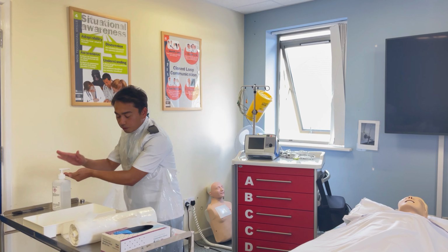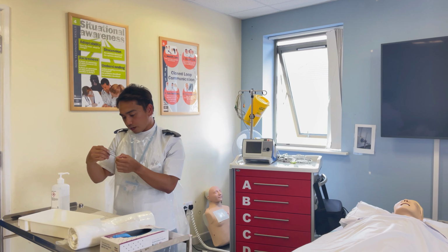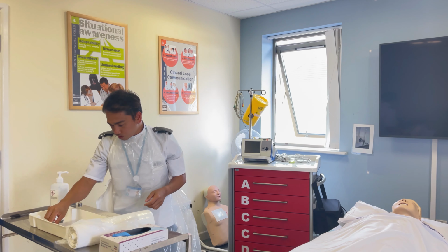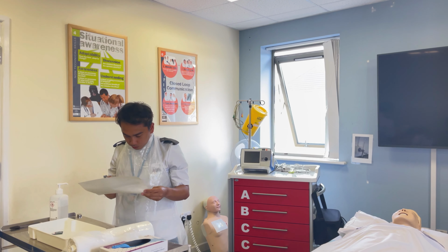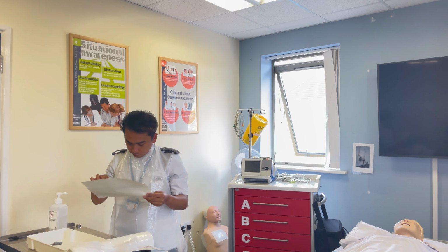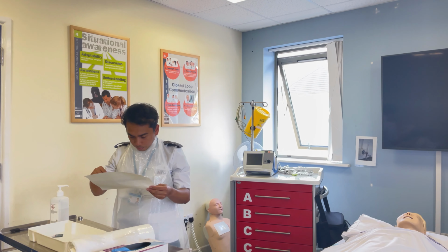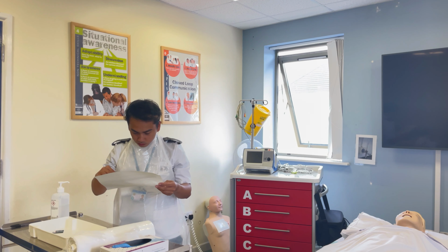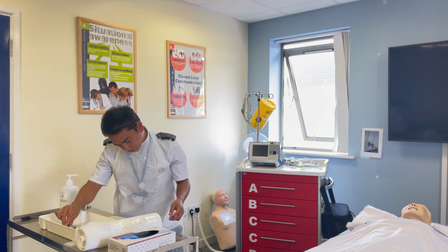I'll be preparing my materials. So I have here an alcohol swab, which is dry, intact, and in date. I also have a normal saline flush, which I'm going to check with my prescription. It's 0.9% normal saline flush, 10 ml prefilled syringe with batch number 593490. Expiration date is 04/2023. So it's dry, intact, in date, and no precipitate.